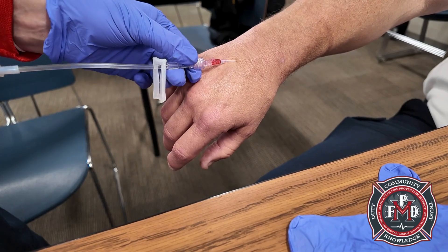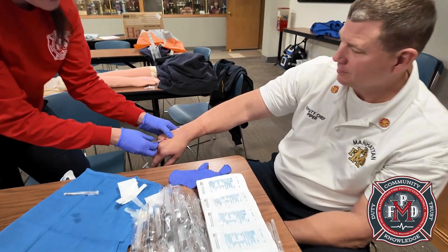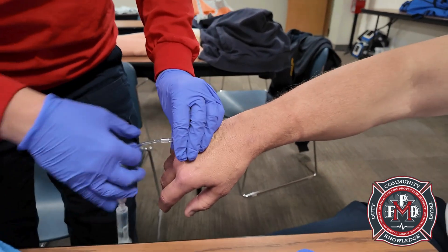It won't go in. Guess we should have listened and used your other hand — sorry about that.